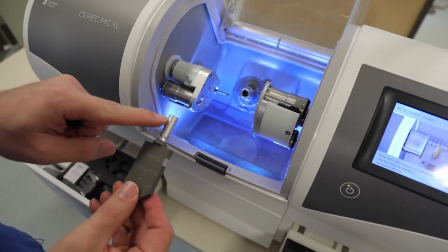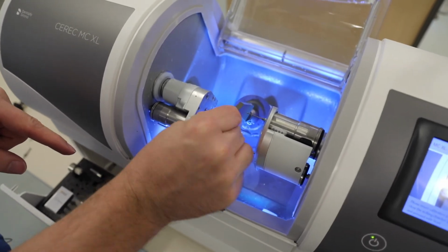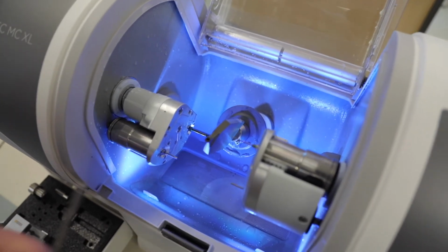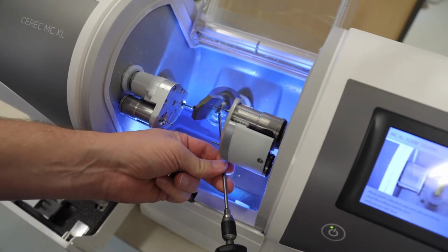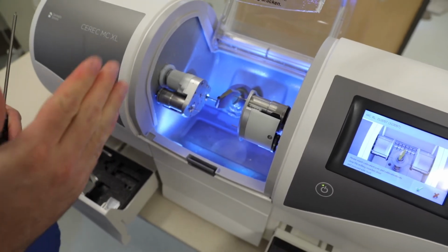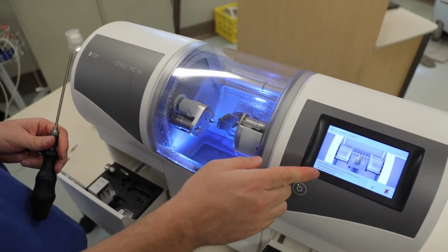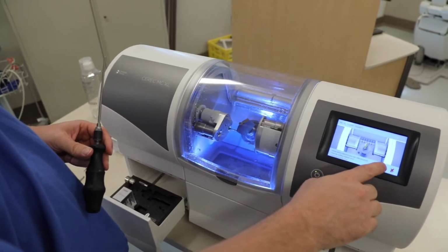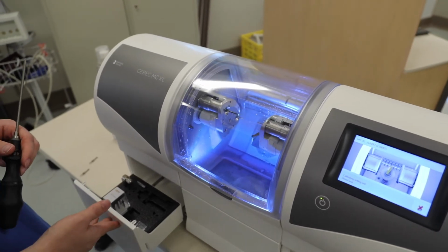And now you'll see the notch. And for your plate, just insert that till it seats, turn it till it fits in and locks out, and then use your torque wrench and adjust your ball screw. Go ahead and do that until it torques out. It's nice and firm. Everything's in place. Go ahead and close your lid and just follow the instructions on your screen on your MC XL. Go ahead and say, I've inserted everything, and place a check, and the instruments will start going into place.